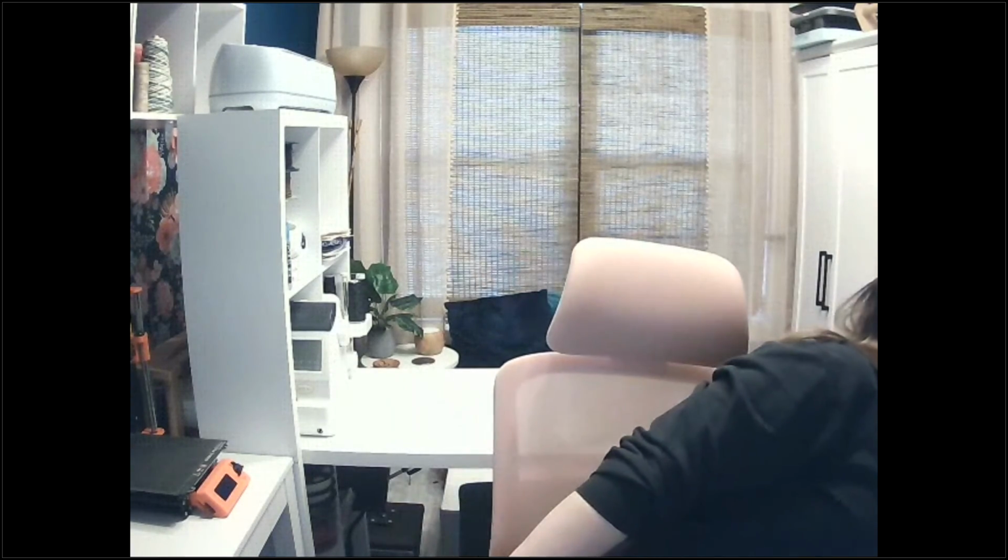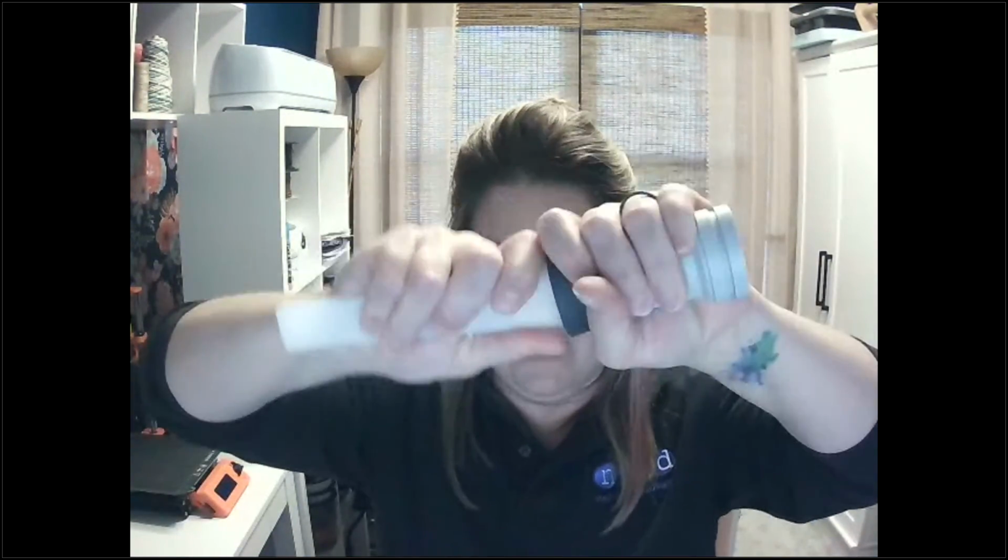So 3-liter syringes. All mouthpieces are going to have different shapes, so you would want to confirm that you have the correct calibration adapter for that syringe. And this one will say CalCheck adapter for the EasyOne flow tube, knowing that that is going to fit exactly onto your EasyOne flow tube mouthpiece. I don't have it in there straight, but that is going to click together and then attach to your syringe. Most syringe openings are pretty universal. There are a few older syringes out there that have more of a traffic cone shape that will not fit onto our adapter.